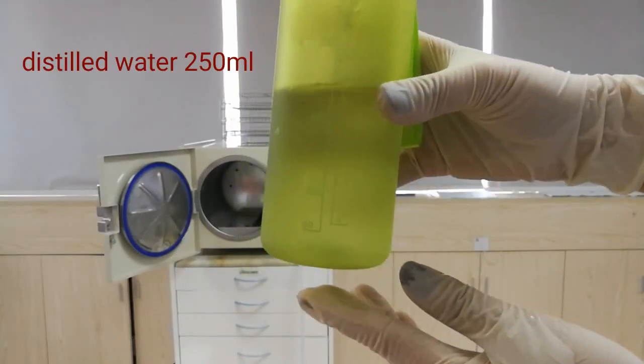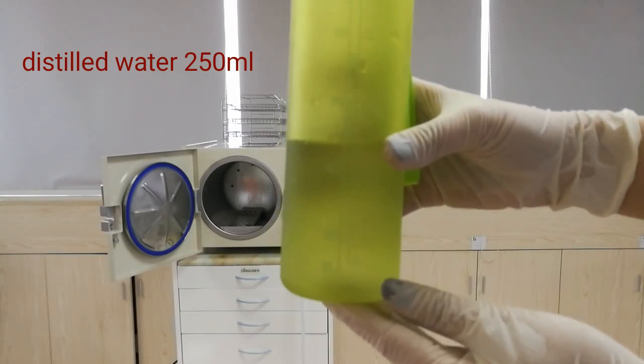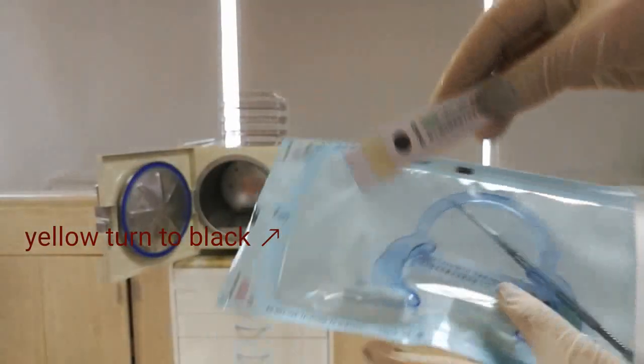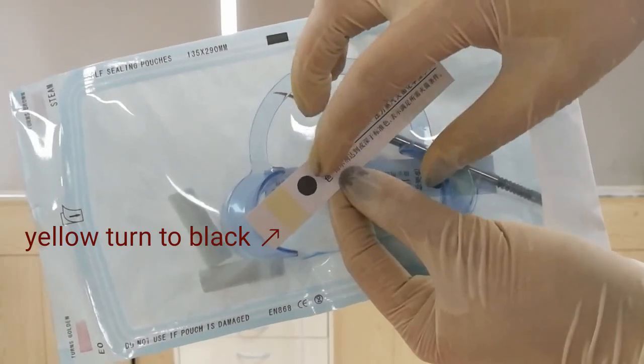Add the distilled water — about 250 ml — just add it directly. Put the objects into the chamber. When the sterilization cycle is finished, the color will become black.